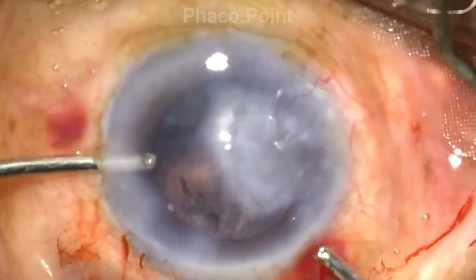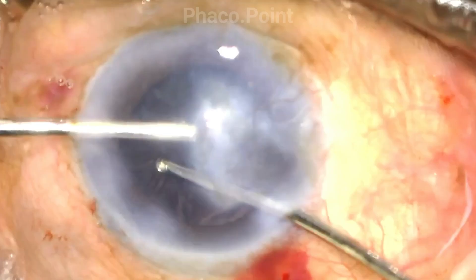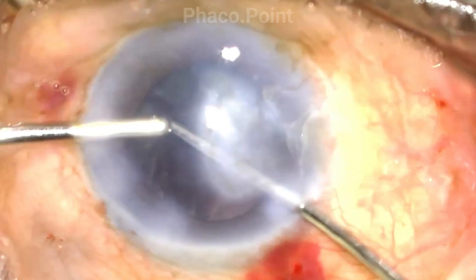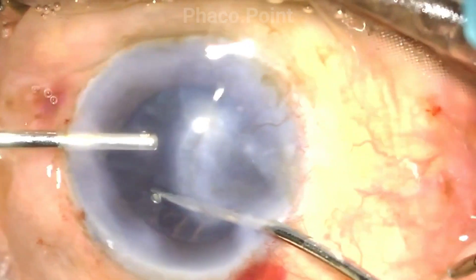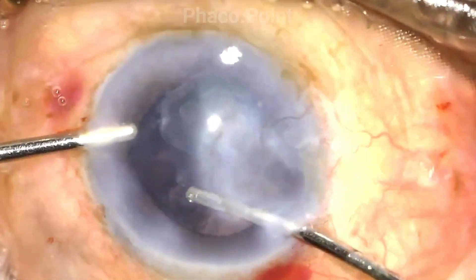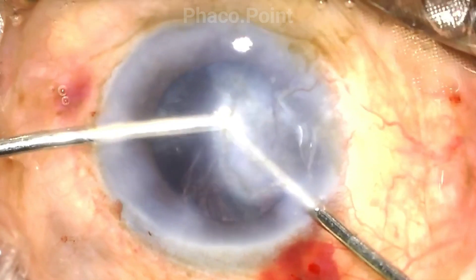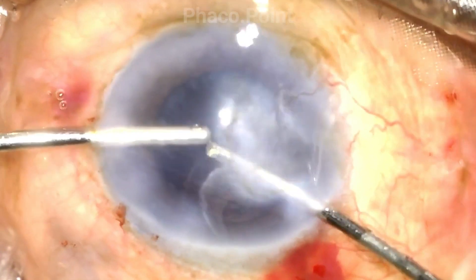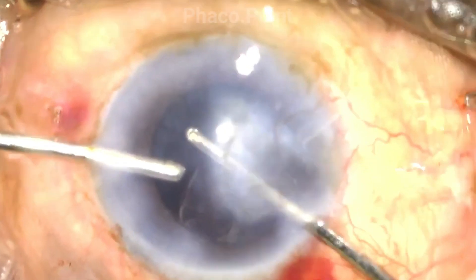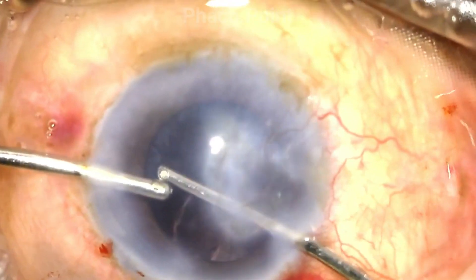We now move to the irrigation aspiration. I prefer the bimanual irrigation aspiration technique for cortex removal, as it allows significant ease and makes it possible even in a challenging case like this to completely remove the circumferential cortex with the mere swapping of instruments.